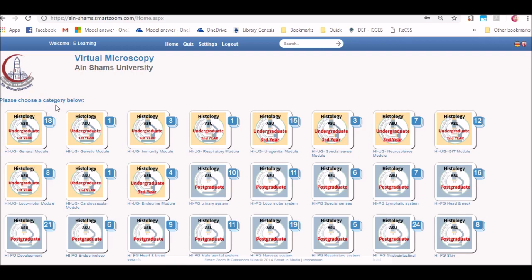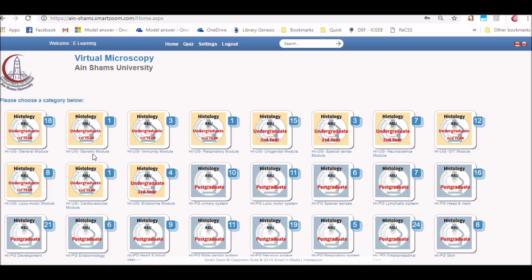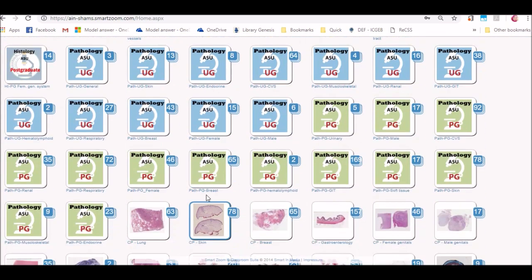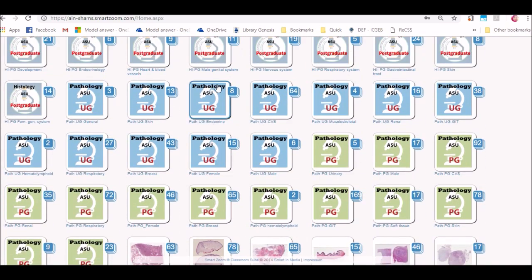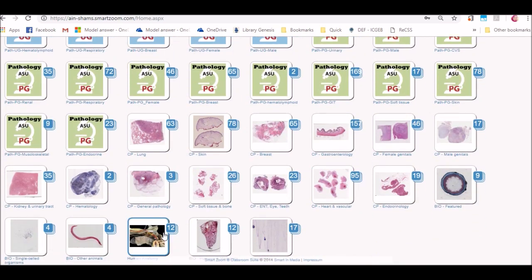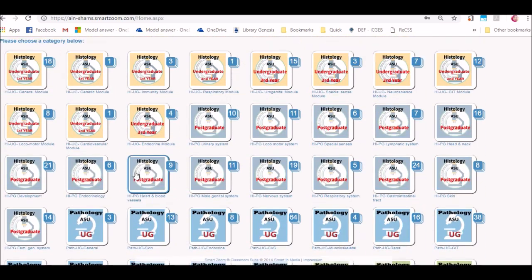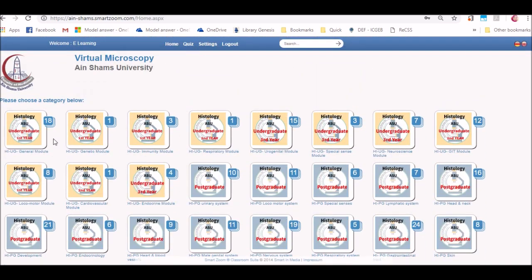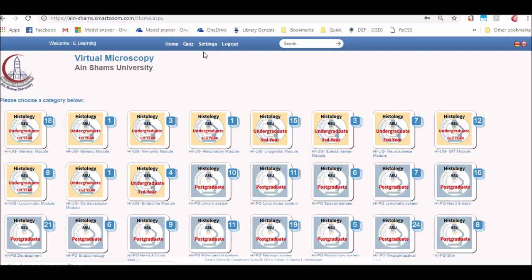Now you can see there are different icons for the different categories. Slides and high resolution images are categorized according to the year or the subject or undergraduate or postgraduate. And on the top, you will find home, quiz, settings, or logout.